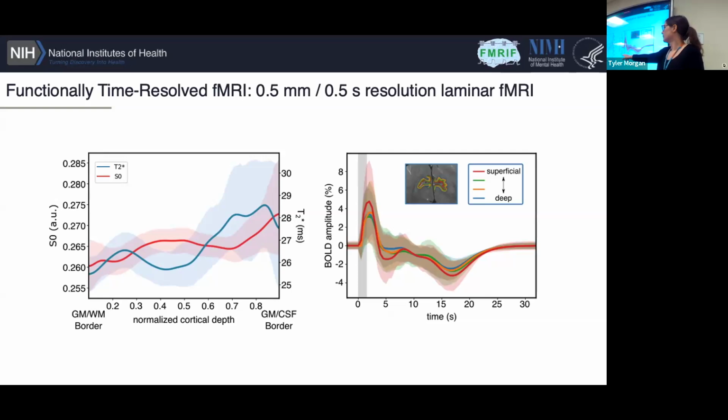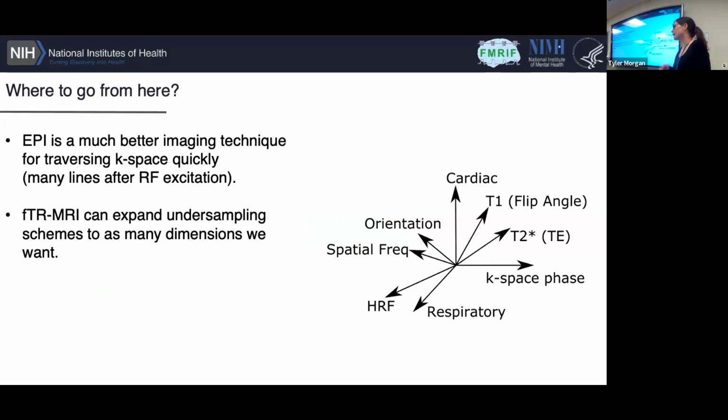stimulus here. And what's more is that we have a very sharp response here, and we have a very long undershoot, which is already pretty interesting. But more importantly, we also have a higher response in only the upper layers as compared to the other ones, and you can see some really differences as well. So those are all interesting things. This is not an analysis that is particularly easy to do without upsampling, etc., in other layer studies looking at Lorenzo. Anyway, the point being that those are the things that I was interested in when I was reporting those experiments.